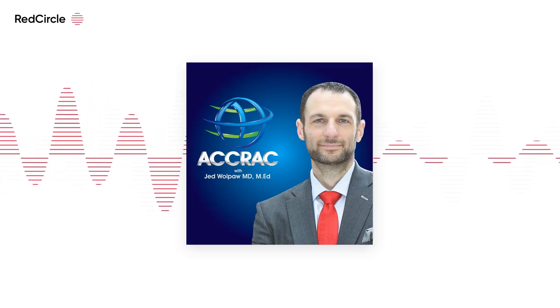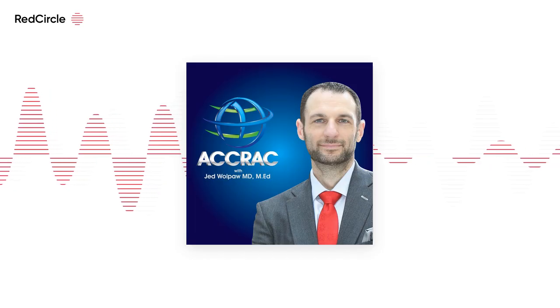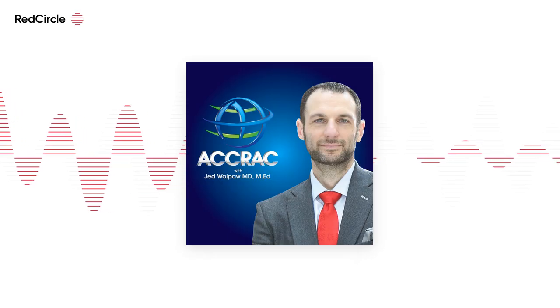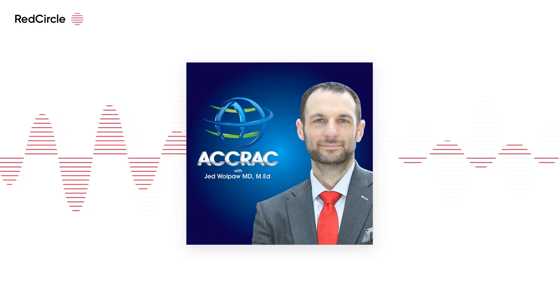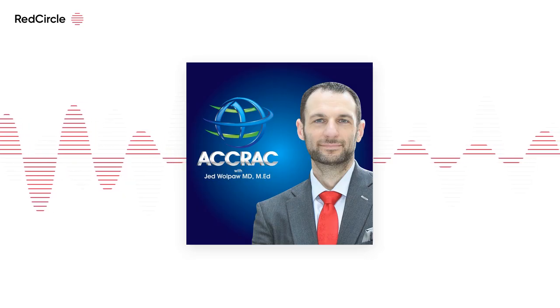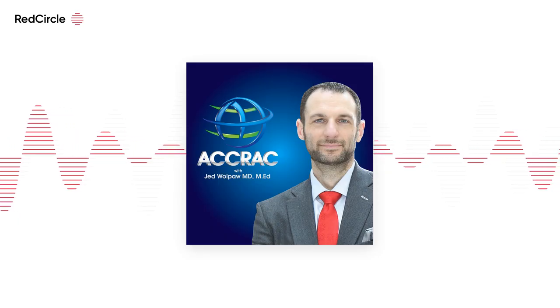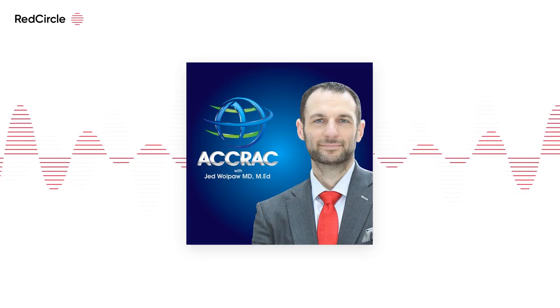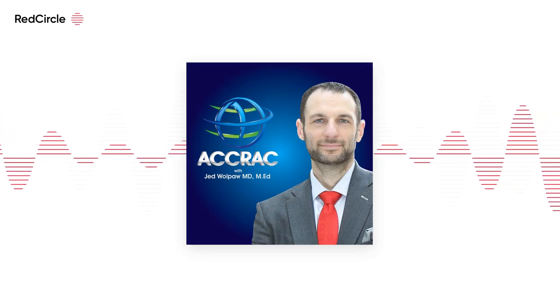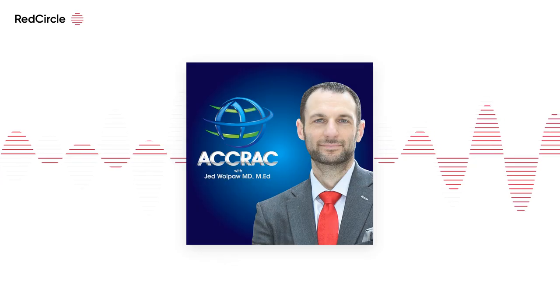So if you are doing the 40 for 40, if you work in a hospital that does 40 for 40 routinely, I highly recommend a PEEP of 25 and pressure control of 15 to more gently open the lungs than just a maximum of 40 the entire time. Hemodynamically is tolerated way better. You don't get huge drops in saturation like you would in some patients when you're at 40. So yeah. Overall, it was more tolerable, but the entire protocol, again, in an evidence-based study, we now have evidence to suggest that that's harmful, but it could have been the aggressiveness of the recruitment maneuver.